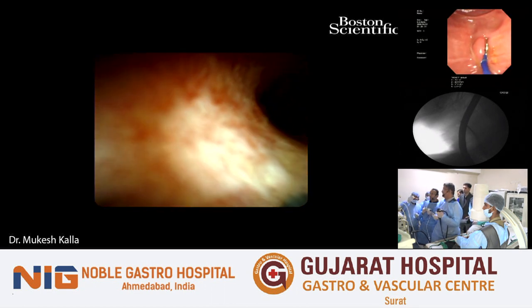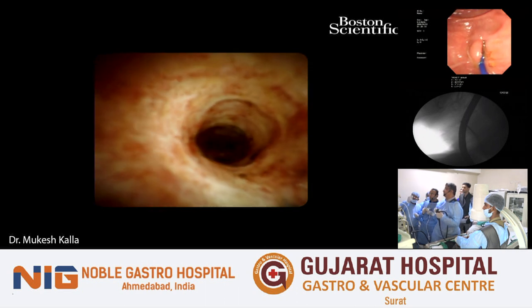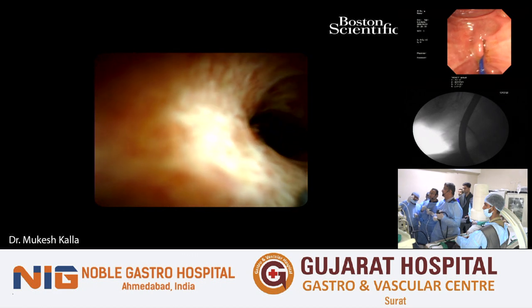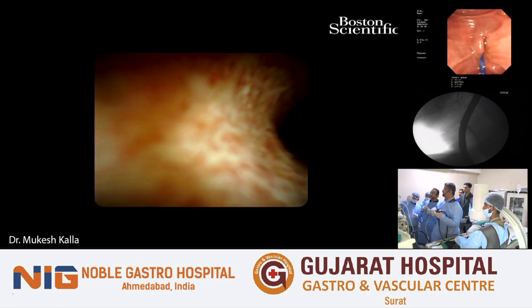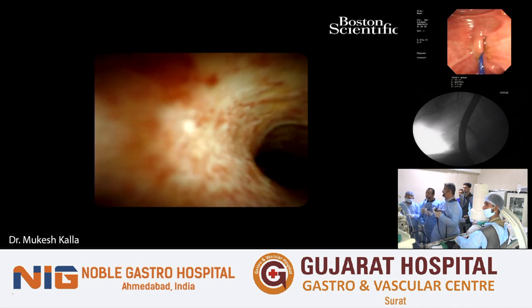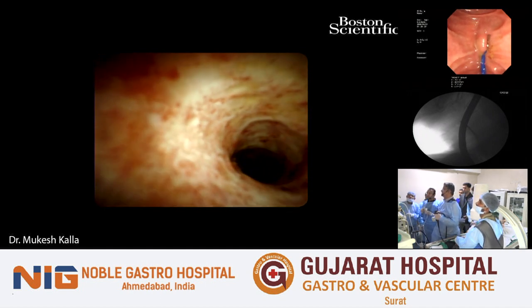So the first thing, centrum rakhna. The first thing we are going to inspect is the common bile duct. Abhi wire thodi bahar le le. Let's go to the hilum, see the hilum, come back, see the cystic duct, and then enter the cystic duct. That's our aim right now.